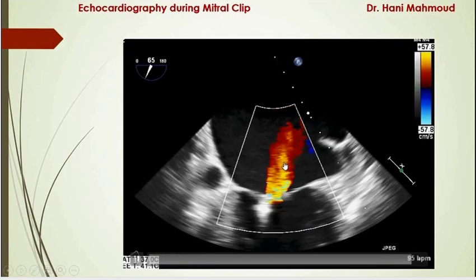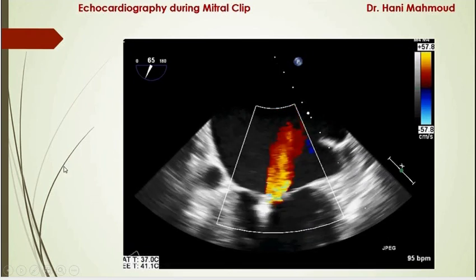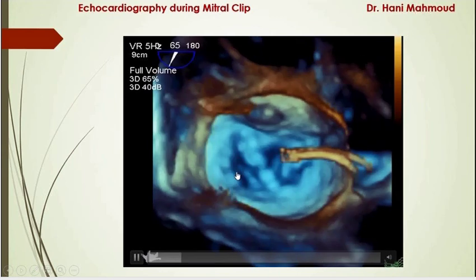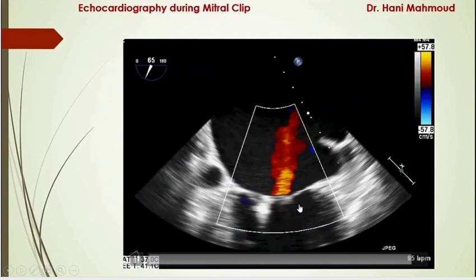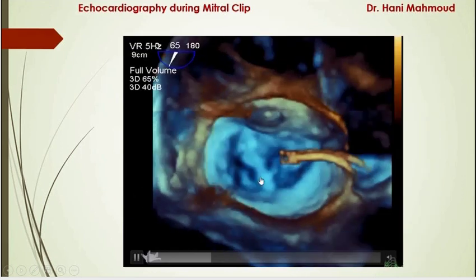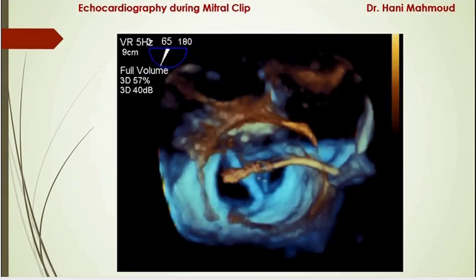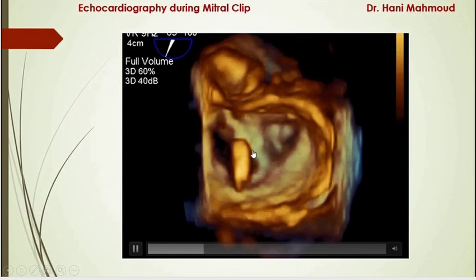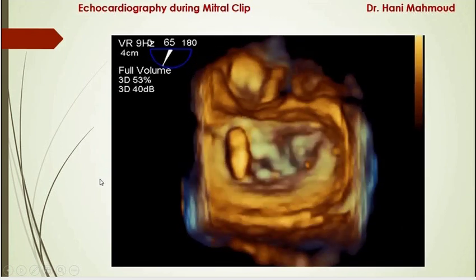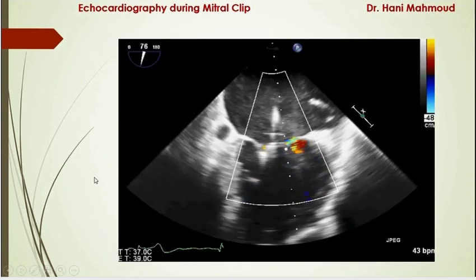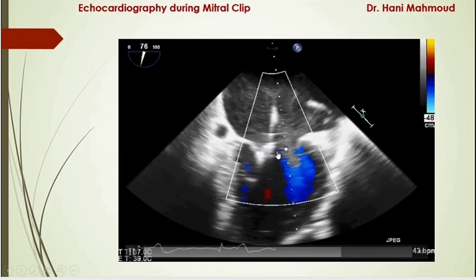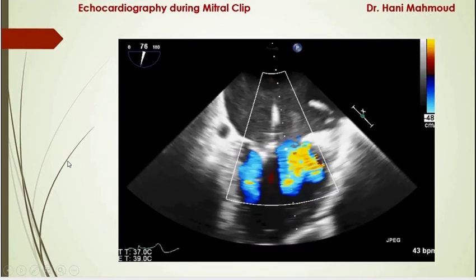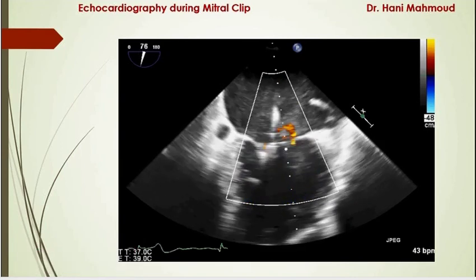After successful grasping, we assessed the result and found remaining significant mitral regurgitation. After discussion, we decided to place a second clip. The medial orifice was smaller than the lateral orifice, and from the previous view we confirmed the regurgitation was lateral to the first clip, so the decision was to place a second clip just lateral to the first. The interventionist introduced and positioned the second clip. After grasping with the second clip, we could see only a trivial jet of MR, and continuous wave Doppler showed no significant diastolic gradient across the mitral valve. The procedure was considered successful.